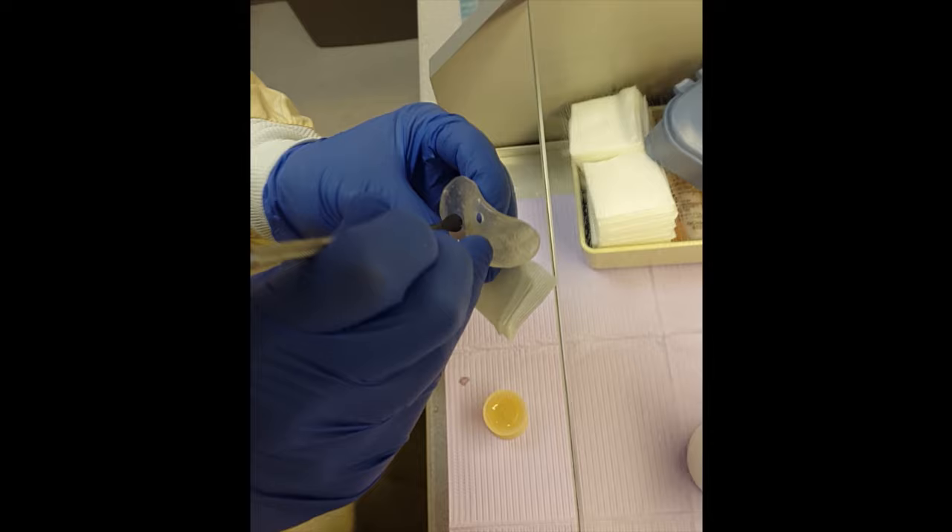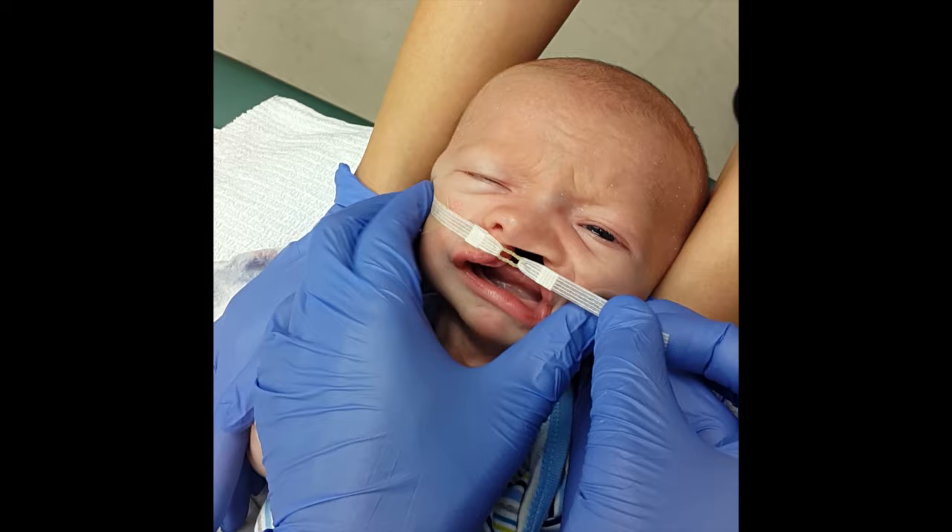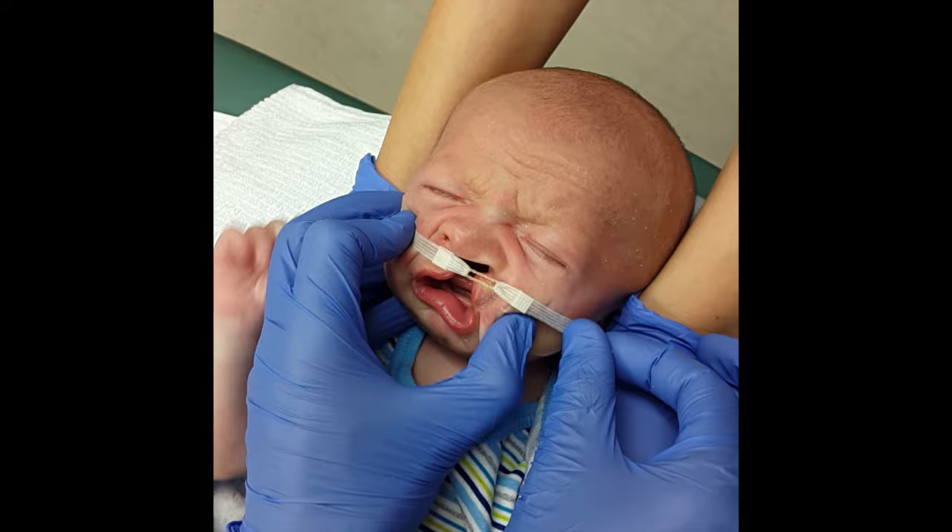Cheek pads are placed outside the crease of the nose to protect the baby's skin. A base tape is then used to help close the gap between the lips. For a unilateral cleft, the tape should be applied first to the non-cleft side, then stretched across the cleft while squeezing the lips together.